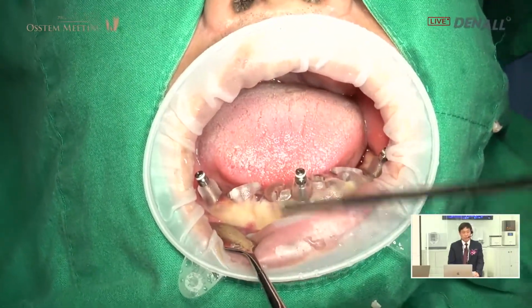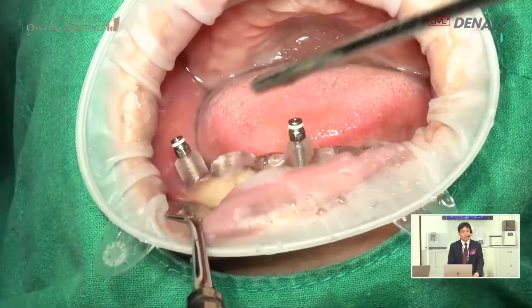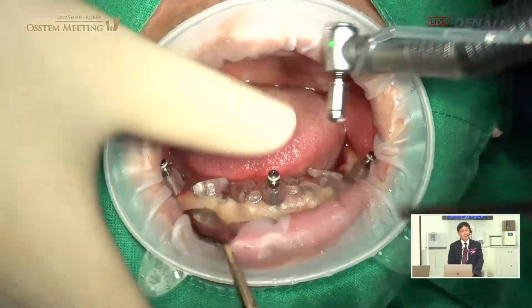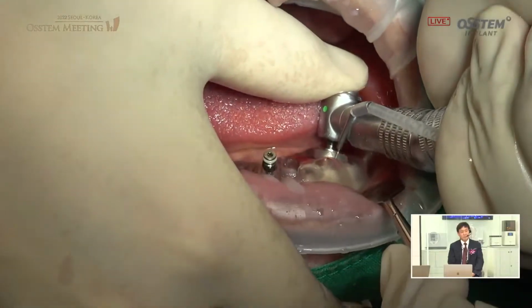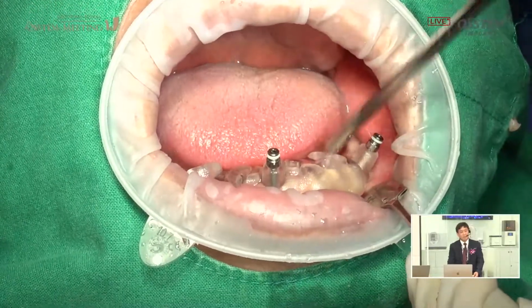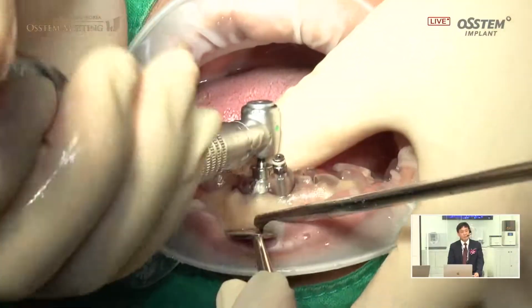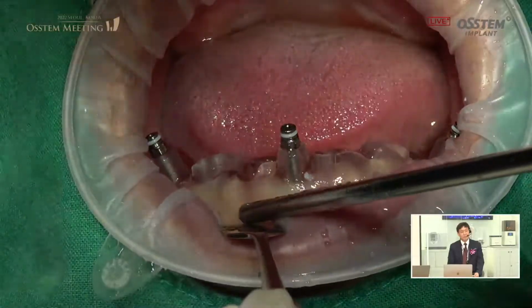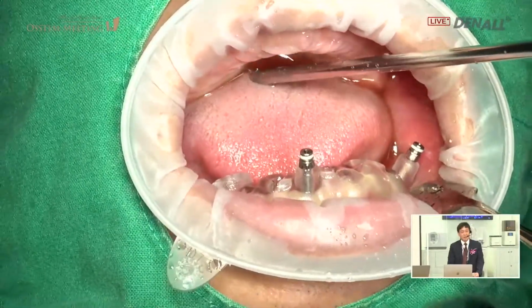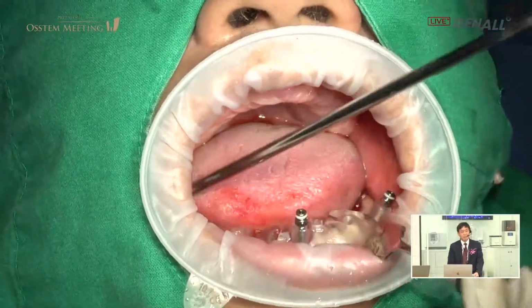As a surgeon, among the different components of the Osstem OneGuide kit, the flattening drill has clinical meaning in that it's very useful. It has the most clinical meaning because it provides a tool to maintain the implant long term. Using the tool you can secure the biologic width and make the bone flat. The drill will not slip. Clinically, I believe it's very meaningful.